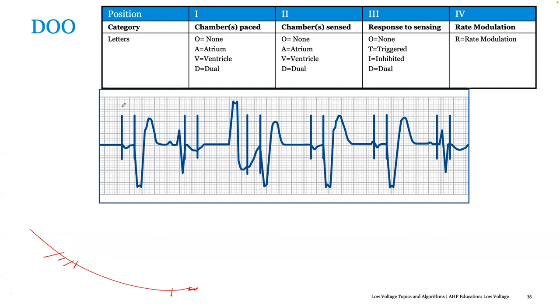I sent you an EKG. If you can look at it, the history is the patient had this intermittent AV block, a third degree heart block. So we put a dual chamber pacemaker in the patient. After that, we sent him back to the referring cardiology.